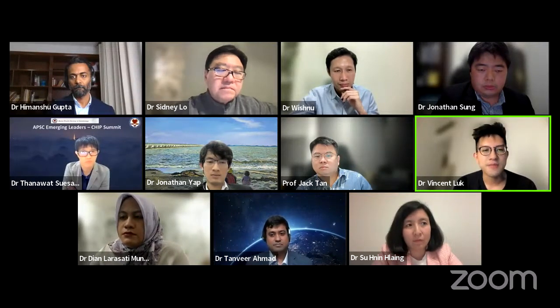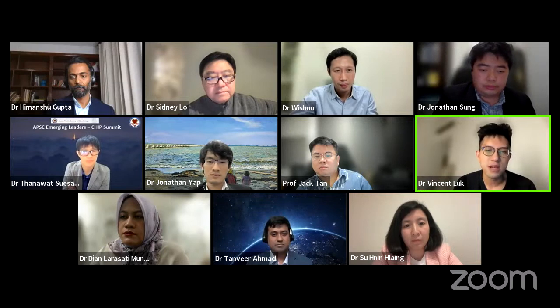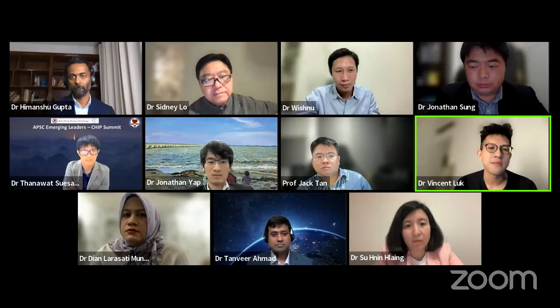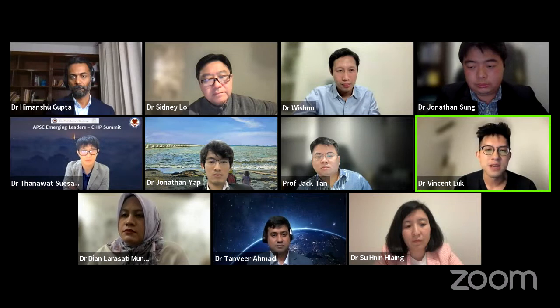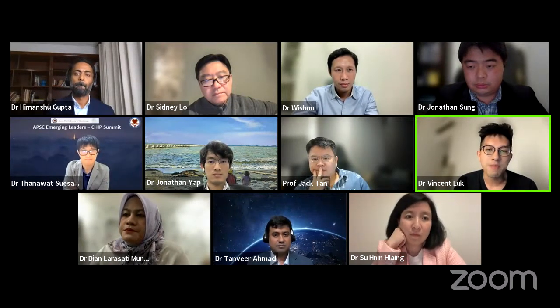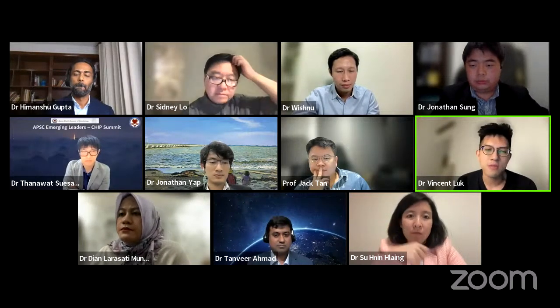So in case of eccentric calcification, I tend to use orbital rather than rotablation. But of course, if you have circumferential calcium or a really tight, small lumen, then rotablator is probably the first to go with. And in larger vessels, IVL will be the option. So I fully agree that all these tools, including cutting balloons and OPN, run hand in hand and help in different scenarios. Back to the key answer, I think imaging will help us choose the weapon from our shelf, and in the end the patient had the best outcome.